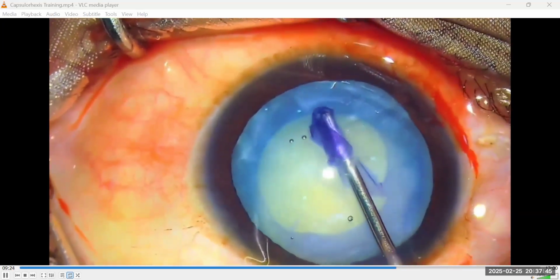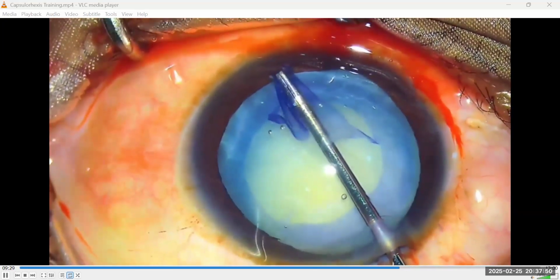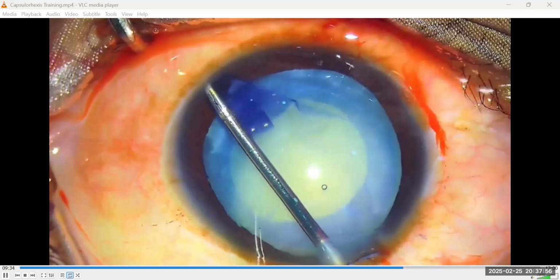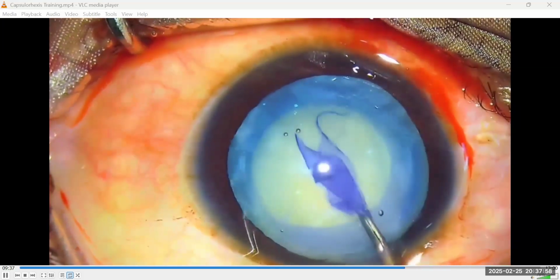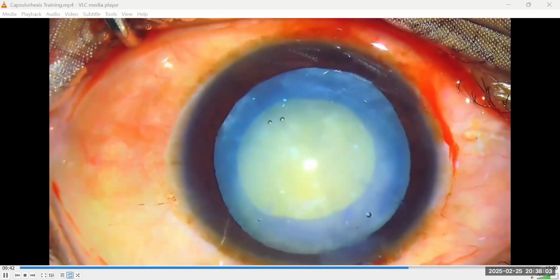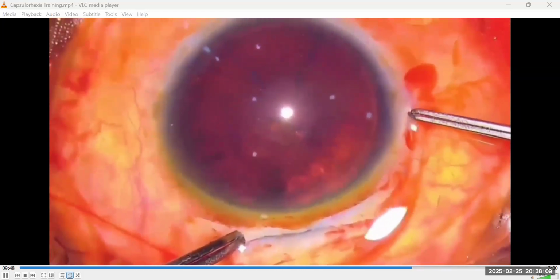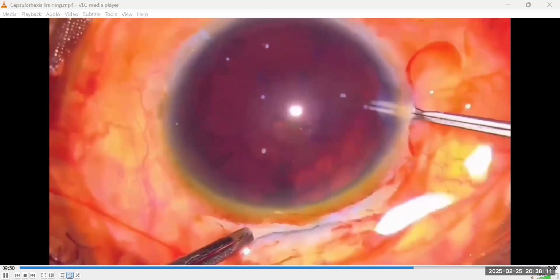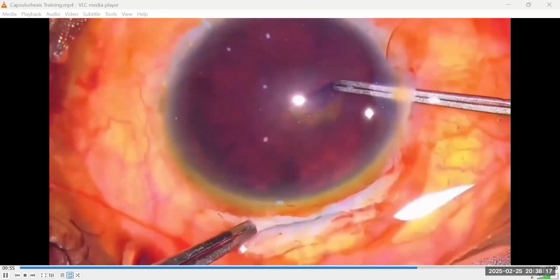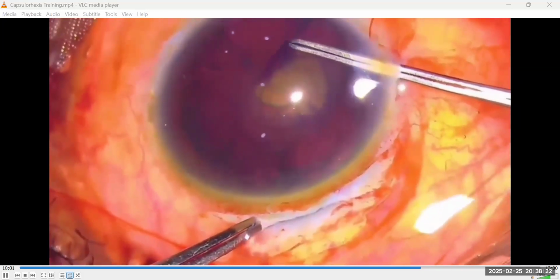So in all of these capsulorrhexis, you are still the surgeon, so you make your surgical decision at the moment. If your decision is to do centripetal pull, you are right. If your decision is to do circumferential tear, you're right. But where will you be wrong? If the anterior chamber is shallow, your decisions will be faulted anywhere. But if the anterior chamber is well formed and the flap is not dancing around your instrument, then whatever decision you take, I will support you. You're right.